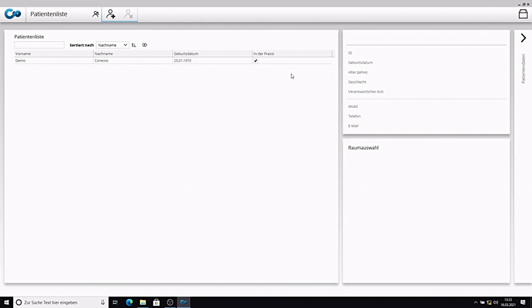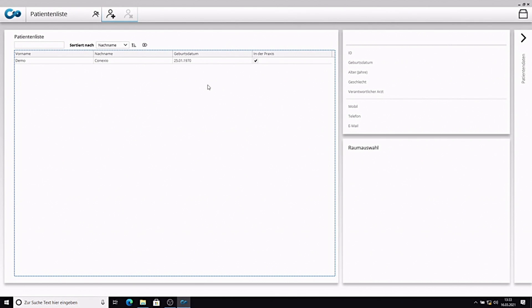After logging into the software, the application window is displayed in the clinical menu. All relevant patient data can be accessed from this menu.